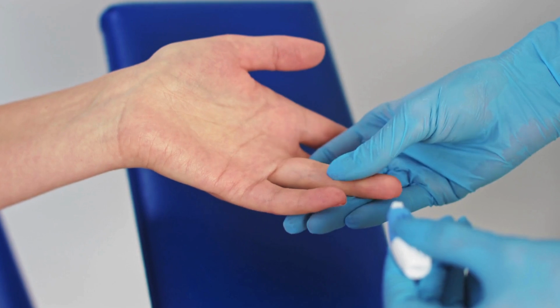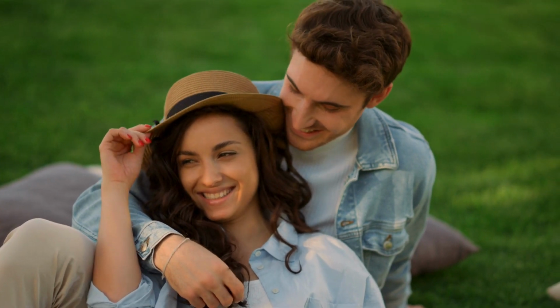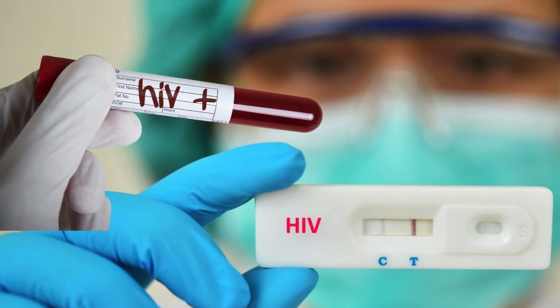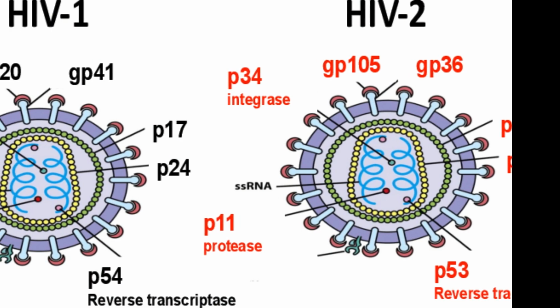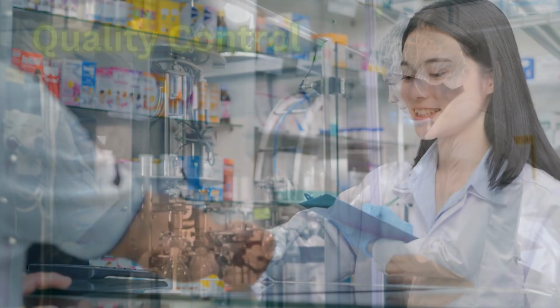On the other hand, the limitations to using HIV rapid testing strips are they cannot detect very recent infections within the window period. Positive results require confirmation with more sensitive lab-based tests. They may not differentiate between HIV-1 and HIV-2, and their storage conditions can affect test performance.